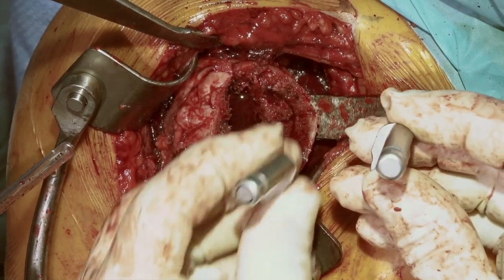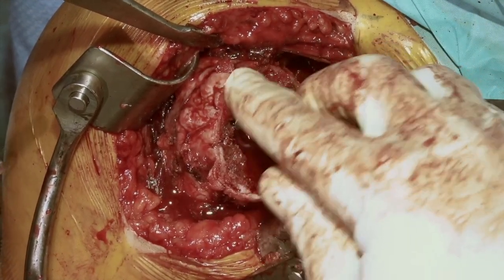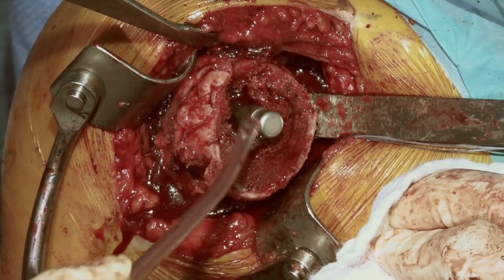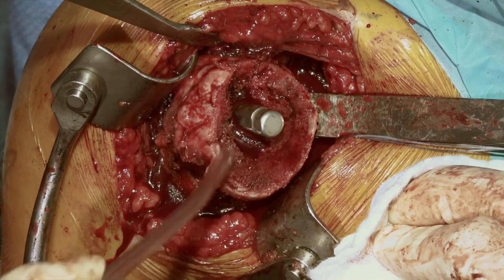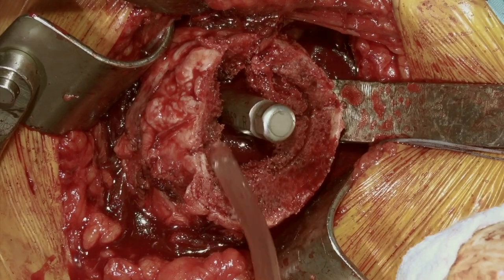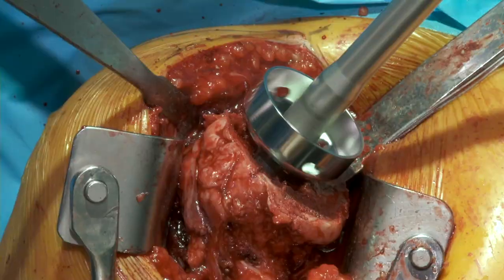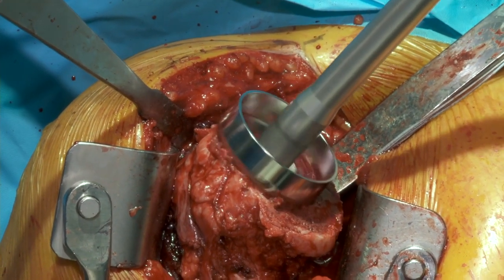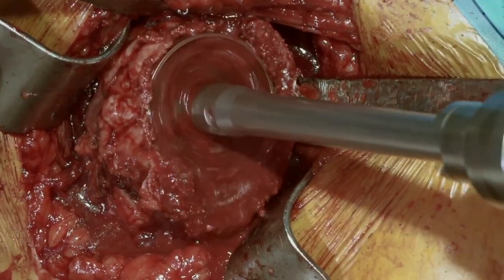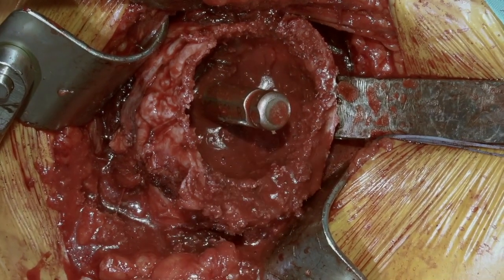This is the one offset to the right, and you can see it puts it back about 2 millimeters. As we put this down the humeral canal, we can see where this sits with respect to the entire diameter — it looks like it's in a good position, sitting more posterior than our actual broach, which is ideal for this reconstruction. We use this guide to prepare the humerus, going all the way down until it seats itself. That prepares the cup for our humerus.